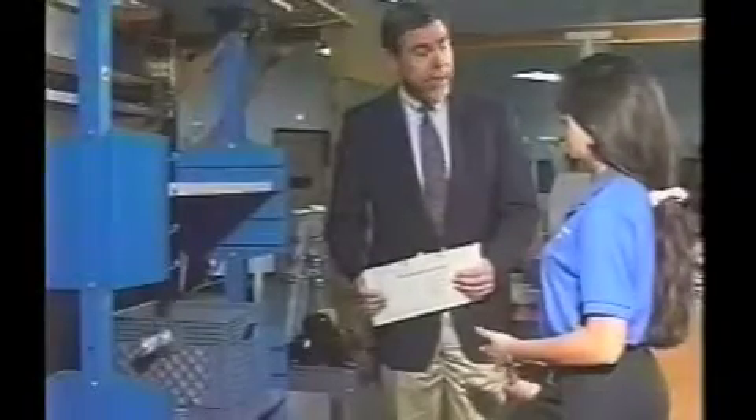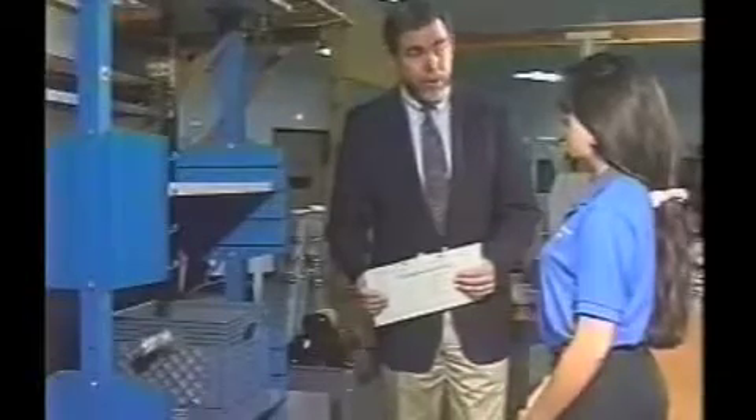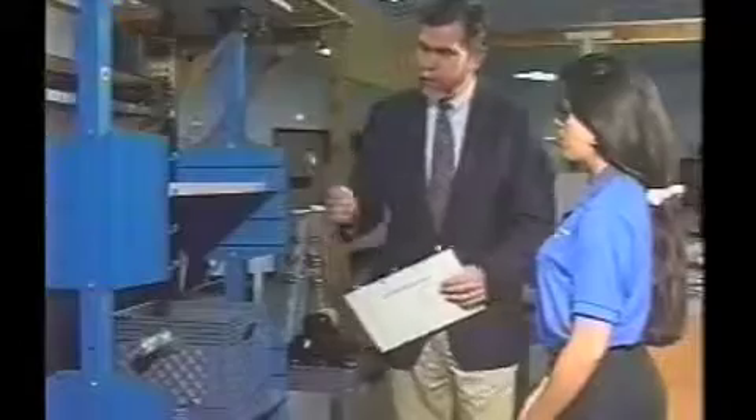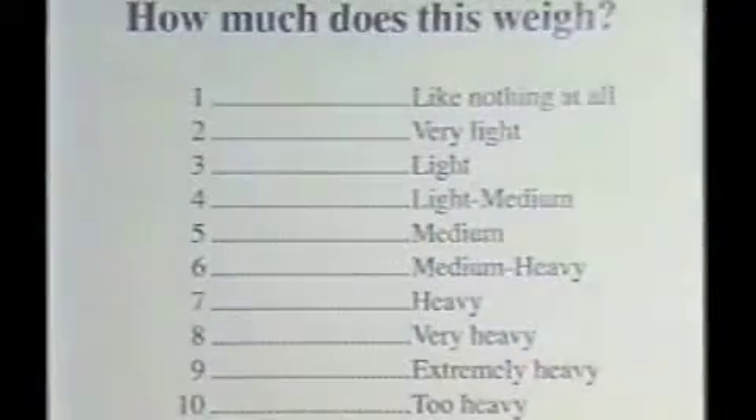Margaret, now we're going to find out how much weight you can lift on a safe and dependable basis, just like you would at work. We're going to start off with having you lift this crate from this shelf to this shelf and back down again. After you've done that, I'm going to ask you to tell me how much it weighs by using this 10-point scale — just select a number that corresponds to your own feeling of how much that weighs, and I'm going to make a note of that.